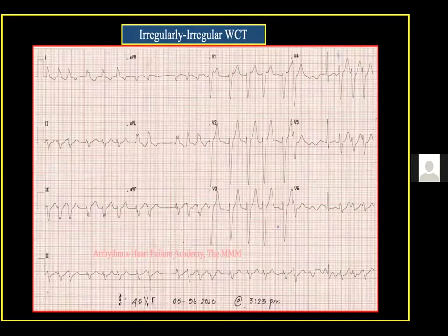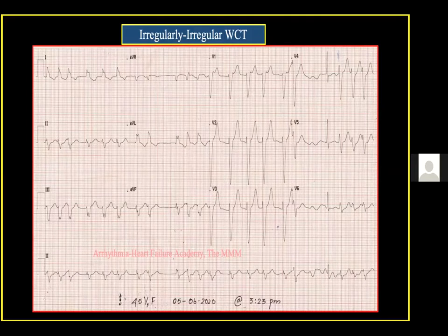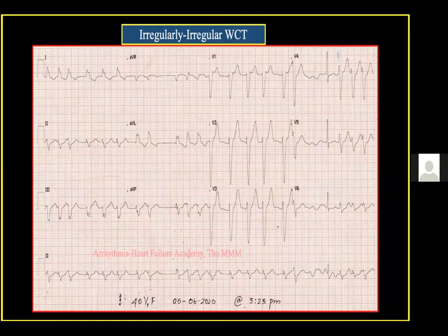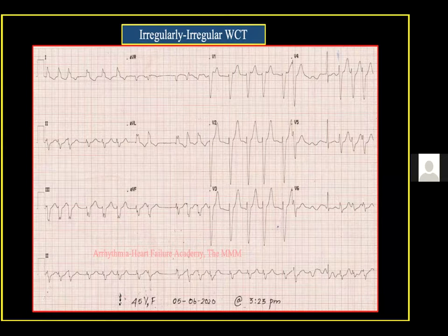Let's look at this ECG to begin with. It's really interesting because it is not so straightforward as to consider VT. I would call it an irregularly irregular wide complex tachycardia. In the absence of P waves, the first choice is going to be atrial fibrillation with left bundle branch block — maybe not a typical LBBB, even though the QRS complexes are very crisp and there is an associated leftward axis with a QS pattern in AVR. It looks like a bundle branch block aberrancy during the atrial fibrillation.